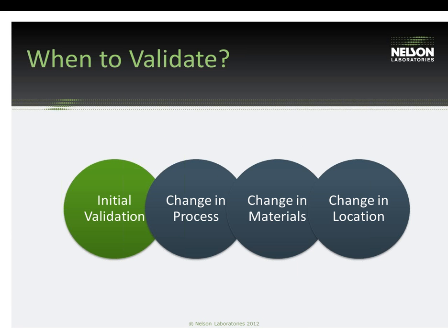So when to validate the cleaning process? The initial validation should be performed when there's no previous data on record for this process. Also, the validation should be re-examined if there was a change made to the cleaning process, such as a change in a step in the process.